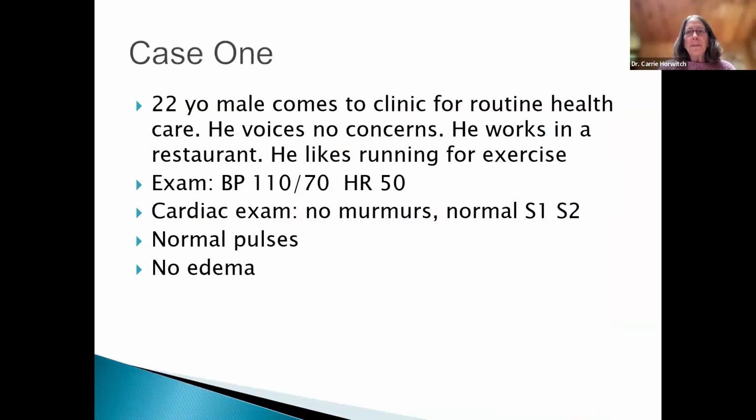Okay, so let's try to put this all together with a few cases. A 22-year-old comes to clinic for routine health care. He has absolutely no concerns. He likes running, he exercises, works in a restaurant. You come in, his blood pressure is 110/70, his heart rate is 50. You listen to his heart with the stethoscope against the skin, and you don't hear any murmurs, and you feel that there's a normal S1, S2, the pulses are normal and no edema. Next slide.